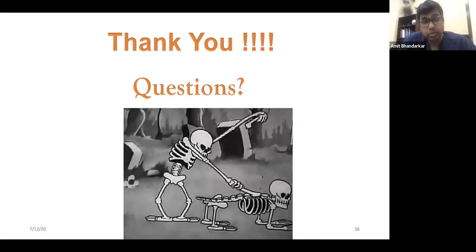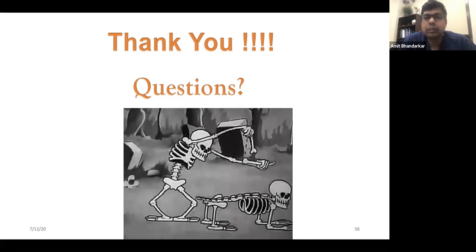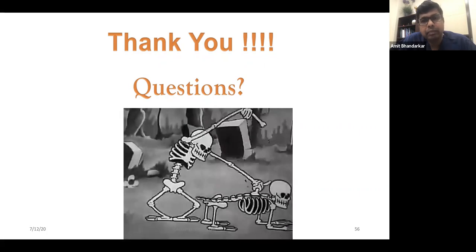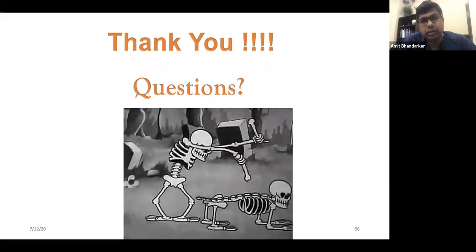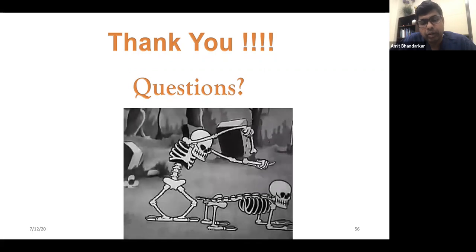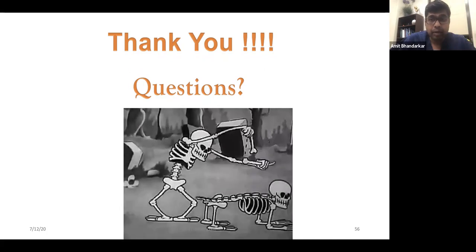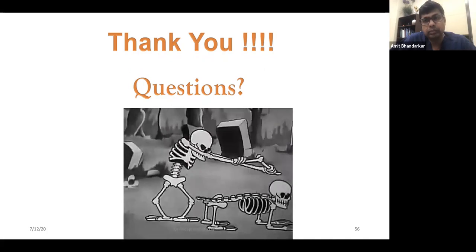Oh yeah, that's a very good question. I don't do transiliac or anything like that, but I have got used to it. In my practice, I do a lot of pain injections. With time, L5S1 was a difficult area to target, the Kambin's triangle. But with time, I got better and more confident. I use a special oblique view with a direct window view, as I call it, to that Kambin's triangle. I'm able to visualize that.